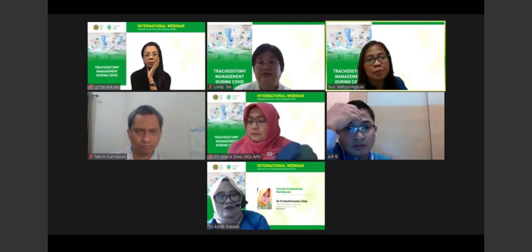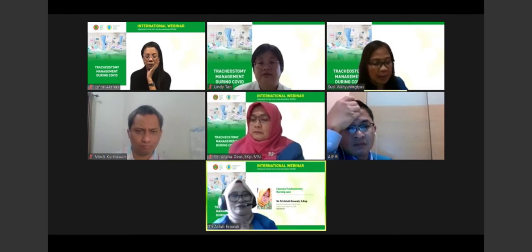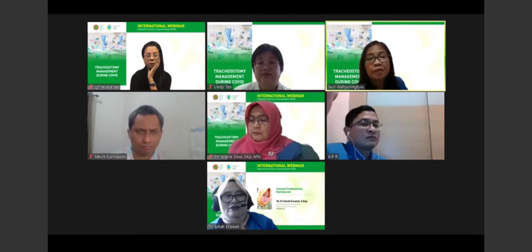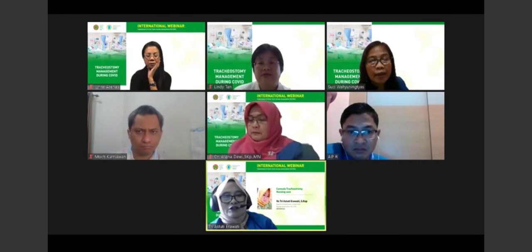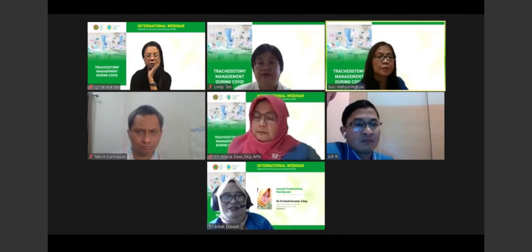But every hospital must be different, also in your country. In Ibu Tuti's experience at Gatot hospital, their standard operating procedure is evaluation for decannulation about once a month. I think that's all.